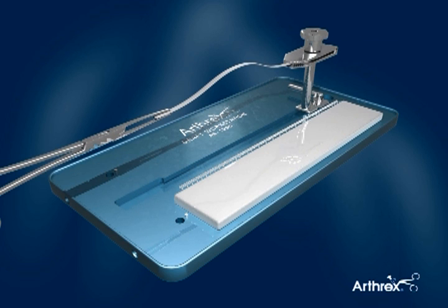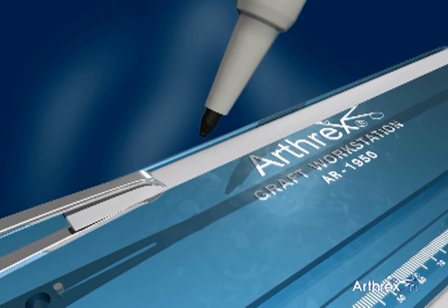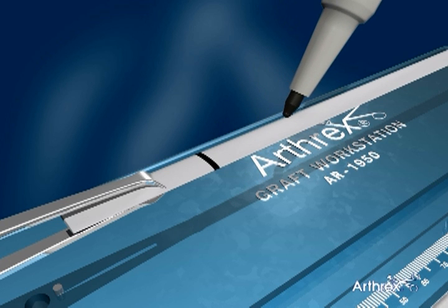Several graft mounting methods have been described and utilized with success. In this illustration, one end of the soft tissue graft is fixed into the Arthrex graft workstation clamp. The free end is held with an Alice clamp and marks are placed corresponding to the limits of the sutured zone.